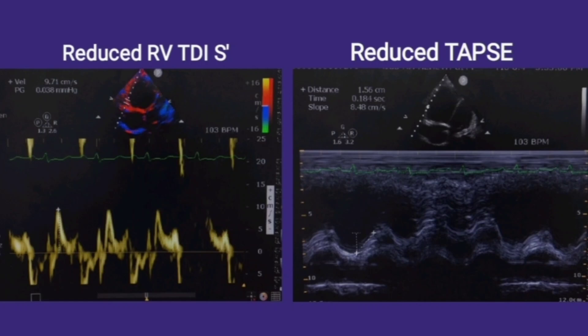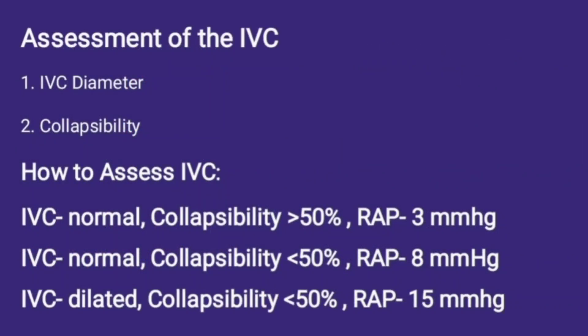The next two parameters help assess right ventricular function. The first image shows the RV TDI S wave, obtained by putting TDI pulse wave Doppler at the lateral tricuspid annulus. An RV TDI S wave of less than 10 cm/s implies reduced RV function. The second image shows TAPSE — tricuspid annular plane systolic excursion — obtained by putting M-mode at the lateral tricuspid annulus. A TAPSE value of less than 17 mm implies reduced RV function.